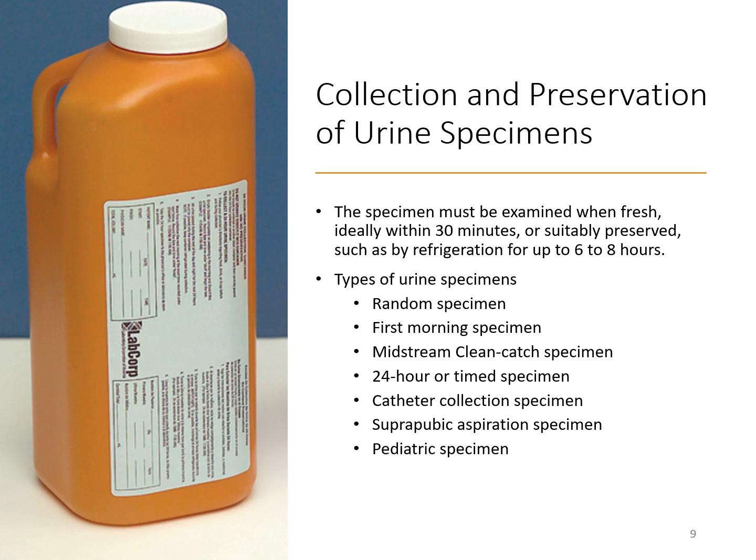Some of the urine specimen types that we will test in the lab would be a random specimen. This would just be any time of the day for any reason. This happens a lot when you go to the doctor's office, and they say, can you give us a specimen? That would be considered a random specimen.